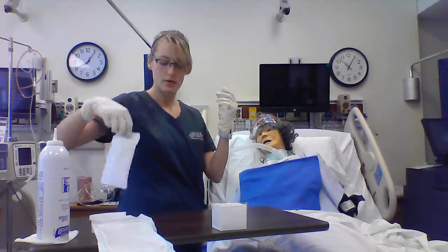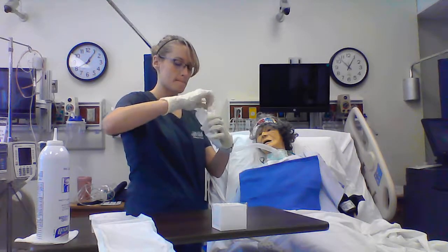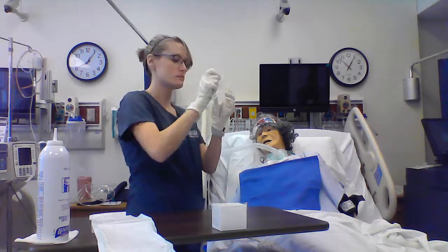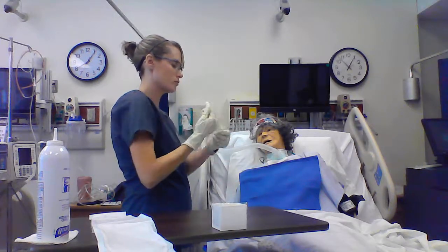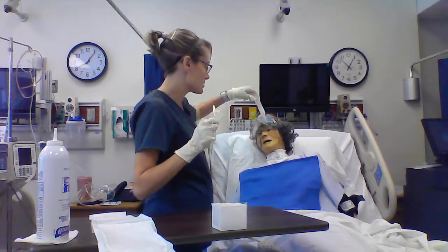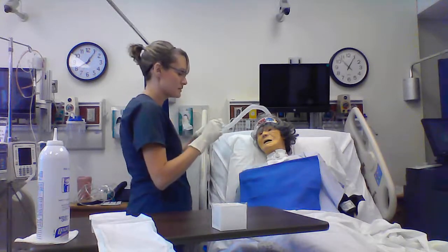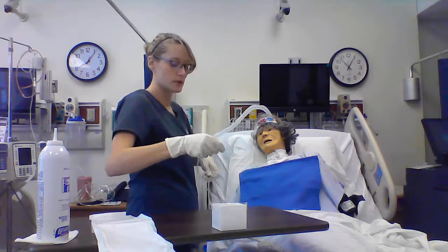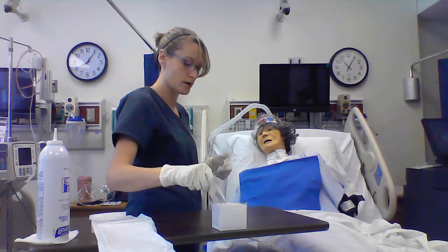I can take out my suction catheter and throw that package away. I want to wrap this around my dominant hand so I have control of it. So I'm going to go ahead and contaminate my non-dominant hand. And I want to remove her oxygen mask and hook my catheter up to suction. I'm going to test my suction and make sure that this catheter is nice and lubricated and working well.